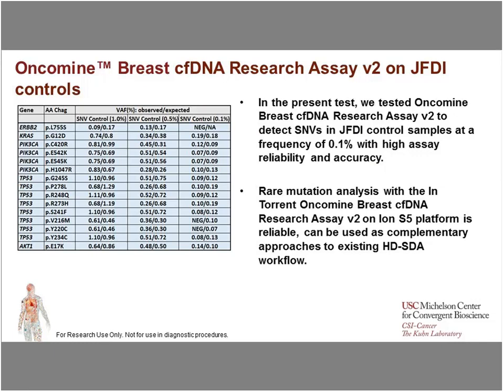So we have done this experiment repeatedly, twice, and not only with the breast research assay, but also with the pan-cancer assay, to make sure all these results are accurate and reproducible. Now we can implement this Oncomine assay into our HD-SCA platform. So they will work together, implemented together as a standardized workflow for our metastatic breast cancer study in the BloodPAC Consortium, Project 007.